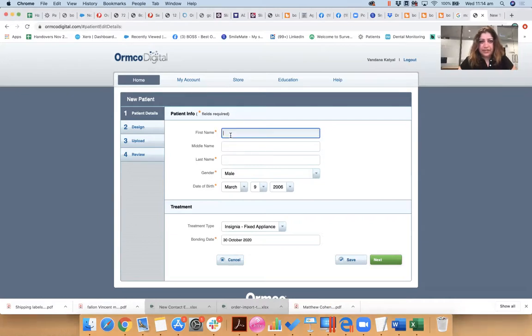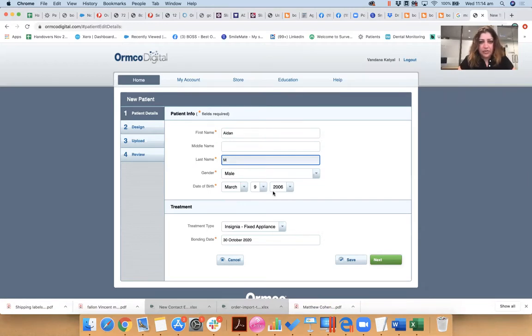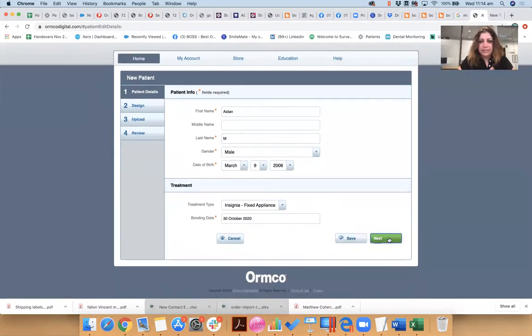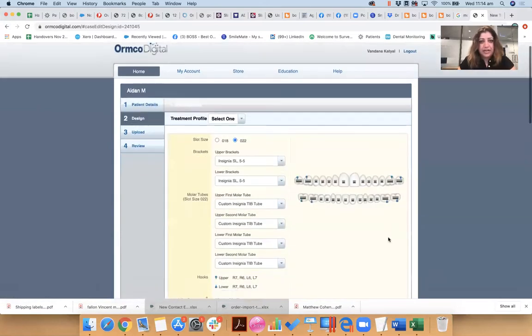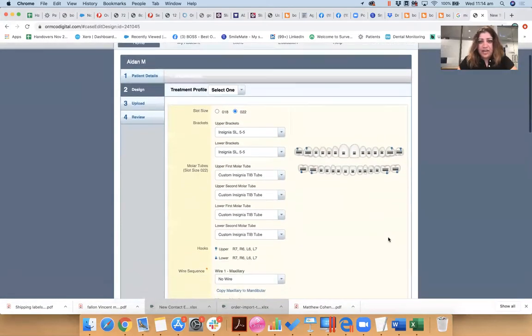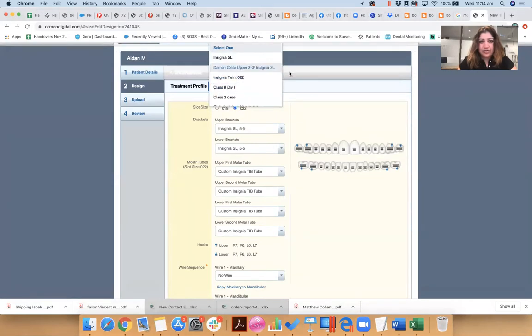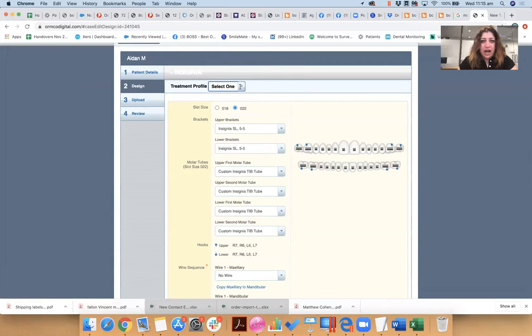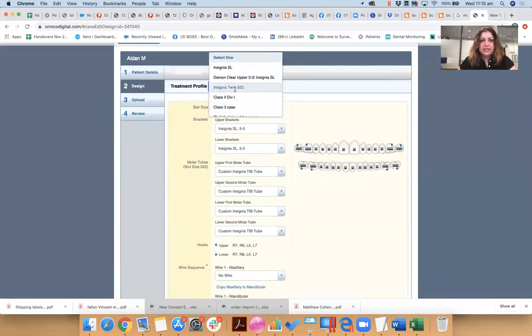So we have a patient here, okay. And this patient we're going to enter. So let's say the first name is Aiden and last name is something. And we are going to set a bonding date about five weeks apart. Now when you're designing your appliances, Insignia will ask you, hey, what kind of treatment profile you want to use.